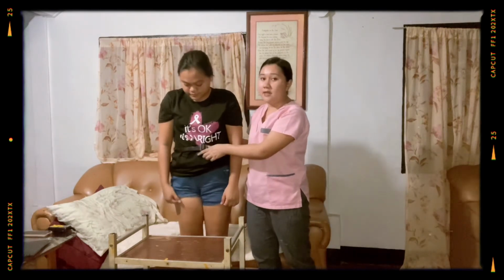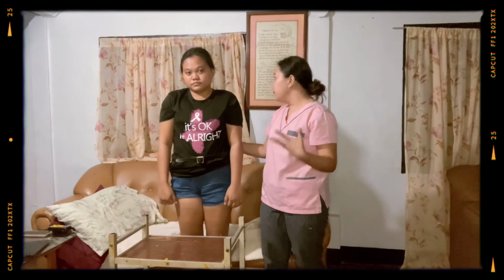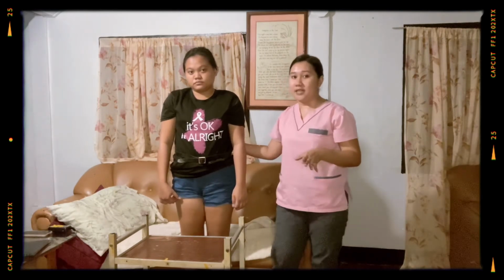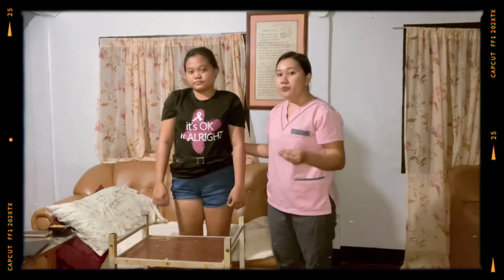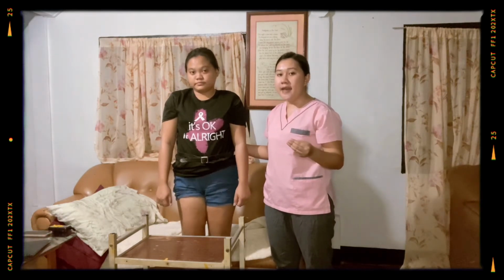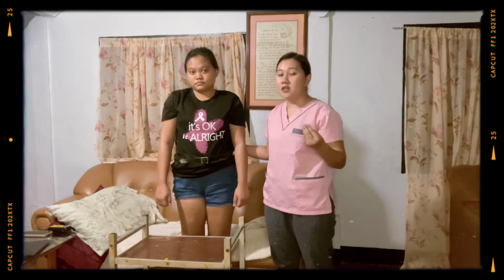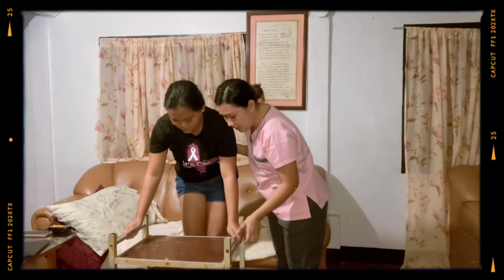So once the patient is standing, have him or her hold the walker's hand grips firmly and equally. So stand slightly behind the patient on one side. So technically, you are going to stand on the weaker side so you can assist the patient properly. So proper positioning of the walker ensures balance standing within the walker, and holding the hand grips firmly provides stability when moving the walker and helps ensure safety of the patient. So positioning to the side encourages the patient to stand and walk. So ma'am, I would like you to hold this firmly, ma'am.